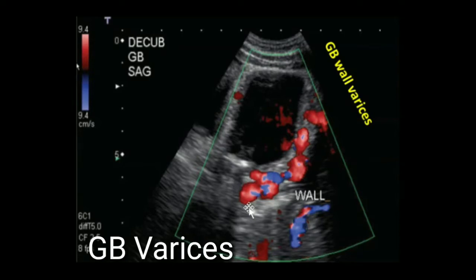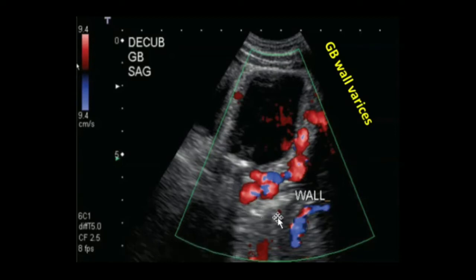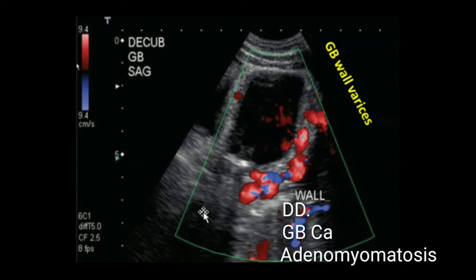In gallbladder wall carcinoma, there is wall thickening with invasion and arterial blood flow possibly seen in malignancy. Another differential diagnosis, which is rare, is diffuse adenomyomatosis — a diffuse wall thickening of the gallbladder that may show twinkle artifact on Doppler. It is therefore very important to differentiate gallbladder varices from adenomyomatosis and gallbladder wall carcinoma.